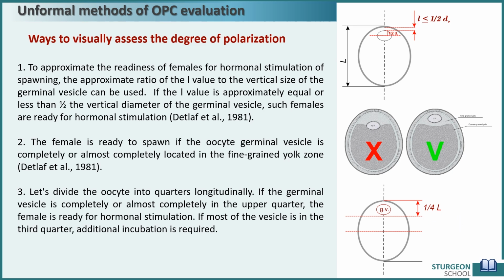In spite of the sufficient correctness of such methods, it is not advisable to start working in this way at once. One should first get one's own database so that we can determine this parameter by eye if necessary.